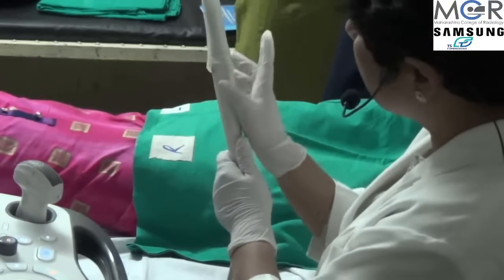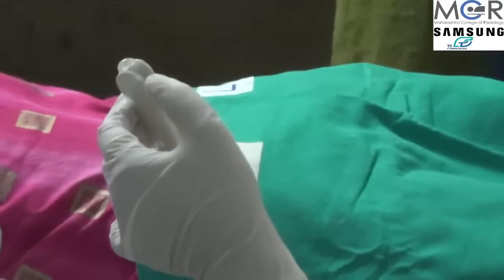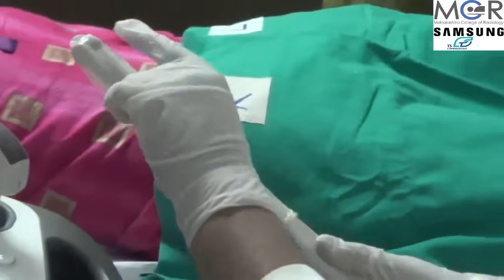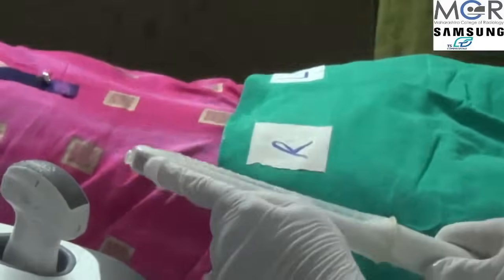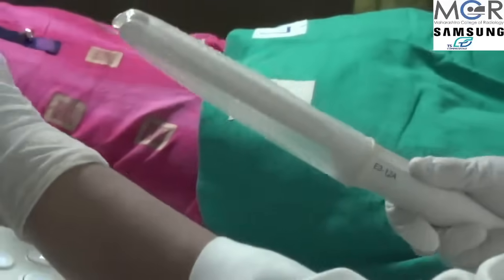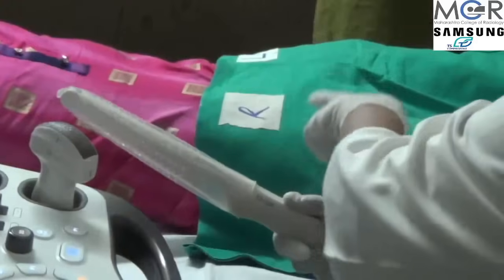You can see this groove over here — this is the standard marker for the probe. This is the tip of the probe. All the images or the part coming in contact with the tip adjacent to this groove would be the anterior portion or the right portion of the patient — anterior structure and right side of the structure — displayed on screen. Whatever comes on top is anterior and whatever comes on the right side of the screen: if you are facing the patient, your left-hand side is actually the right side of the patient.